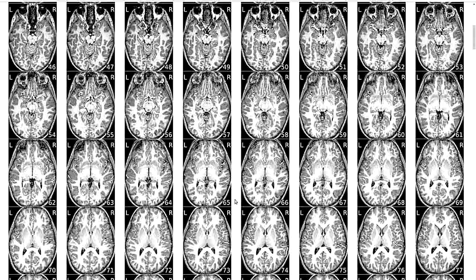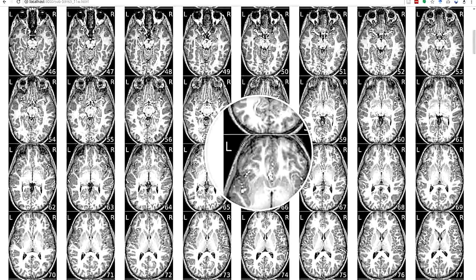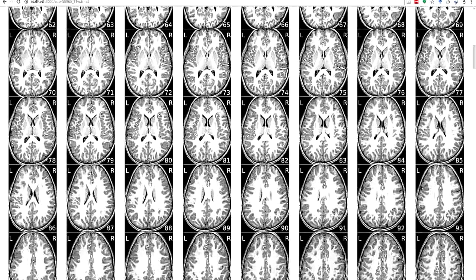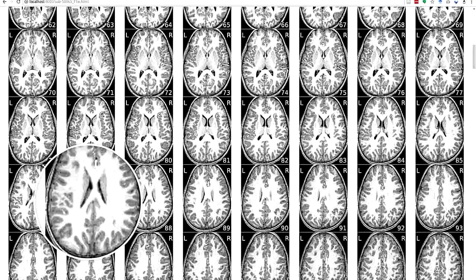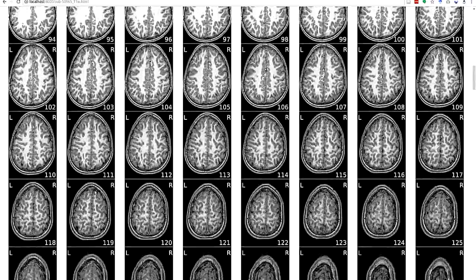And let's go to a second example. Again, the dataset doesn't look very good. Here, you see that there's some blurriness, but there are no clear ripples. So this time, when we find this kind of dataset where you can't really see very clearly if there are head motion ripples, you should go to the background and see what is there. So let's go there.